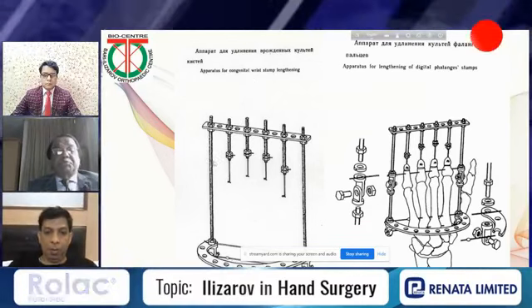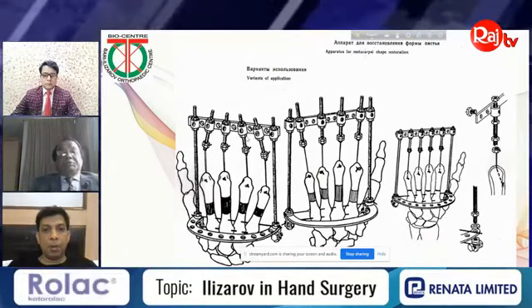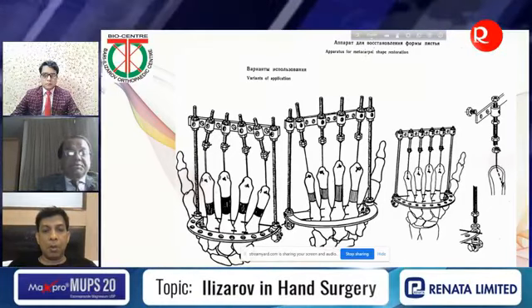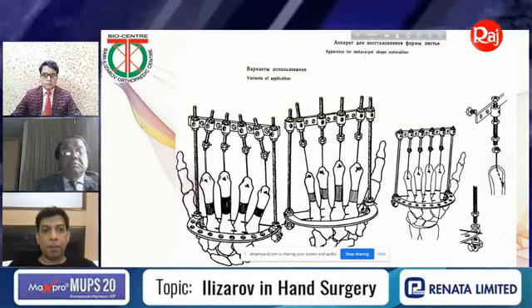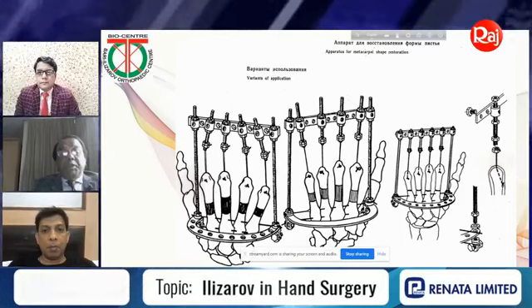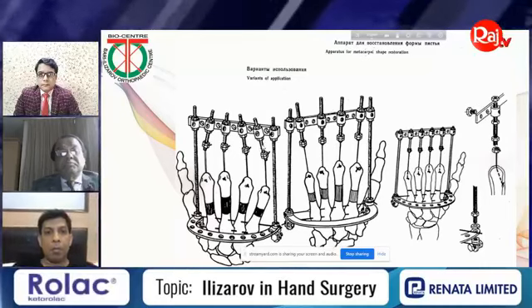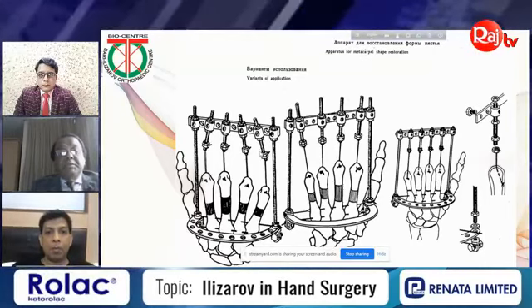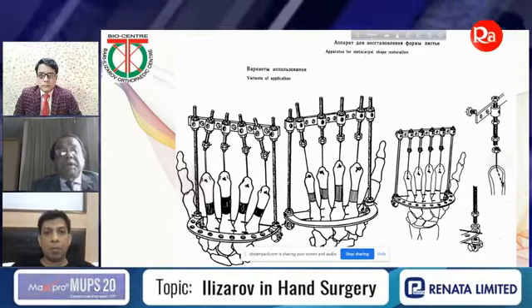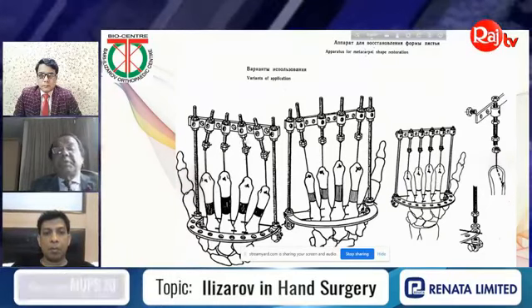This is just a picture I have shown you of how to put the apparatus. Now, here you can see this is a variety of applications. You can put like this, here left side. See, this is regenerated bone. Bow here, just fixed like this. And gradually, whenever you are going for lengthening, just see, here is the nut, here is the nut. Inside and outside, inside and outside. You just rotate 2 times, 3 times, 4 times, depending upon your case.